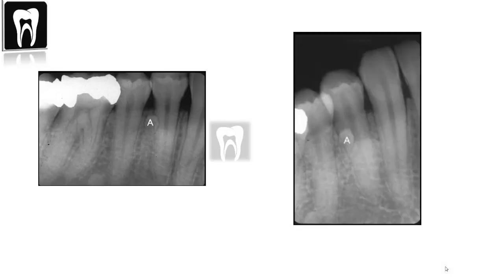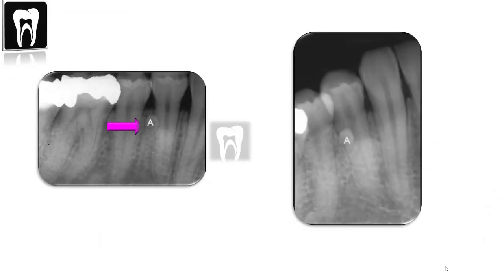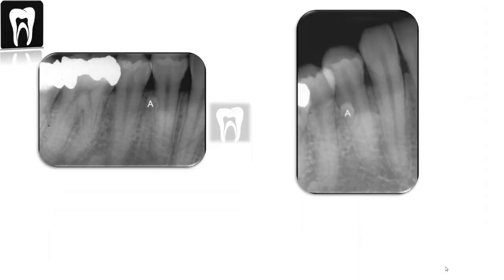This is our first example. We have a premolar periapical radiograph and a canine periapical radiograph. The premolar periapical radiograph would be much more distal and the canine periapical radiograph would be to the mesial. We have a tiny radiopaque object labeled A — it's a supernumerary tooth in the mandible. Using five steps with two images above, image number one is the premolar periapical radiograph and image number two is the canine periapical radiograph.